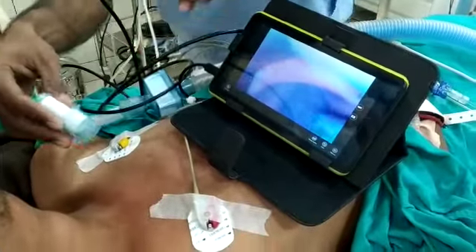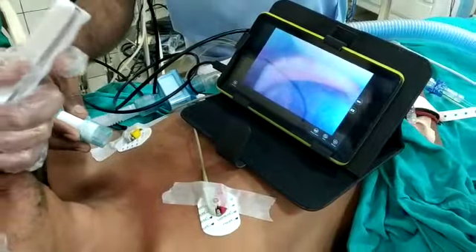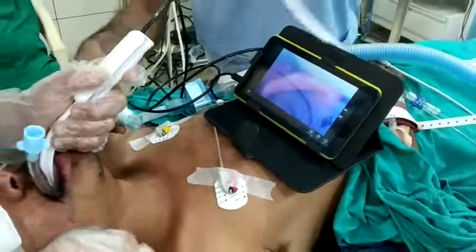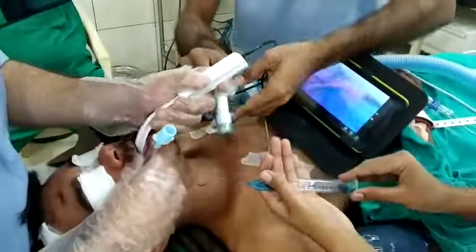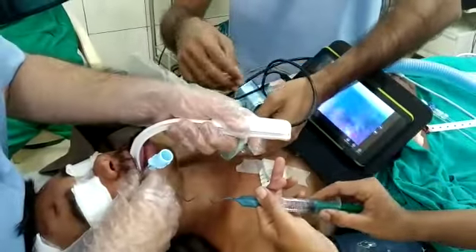Under vision, the tube has entered the larynx — intubation is done. I am now taking the laryngoscope out.